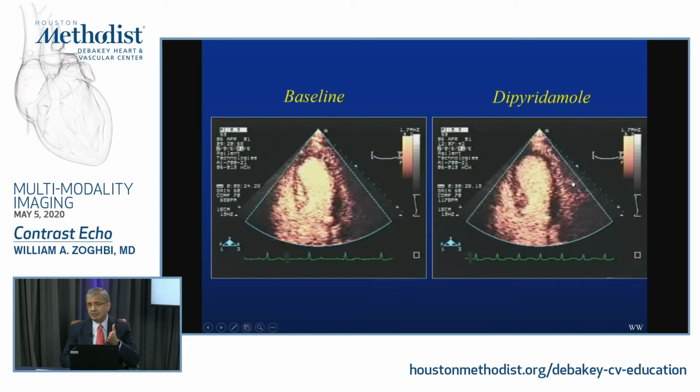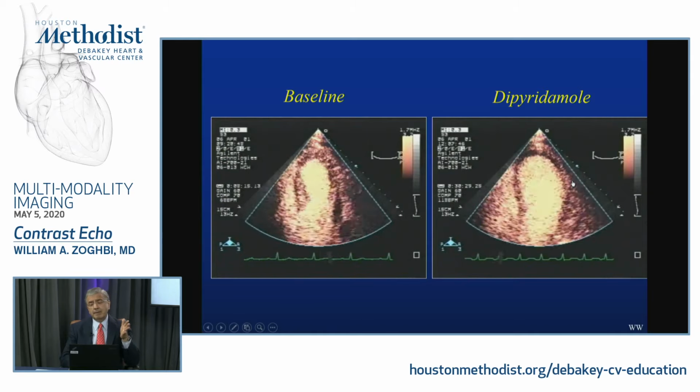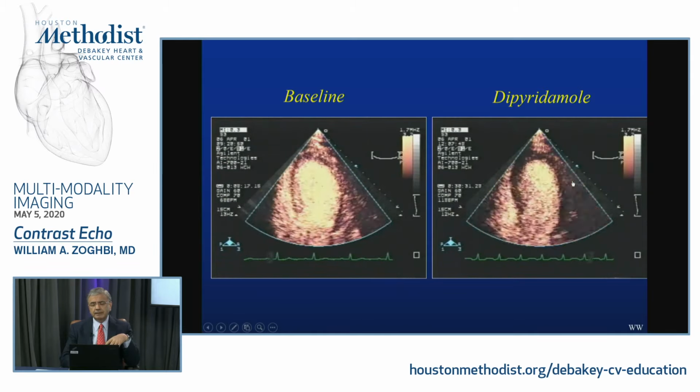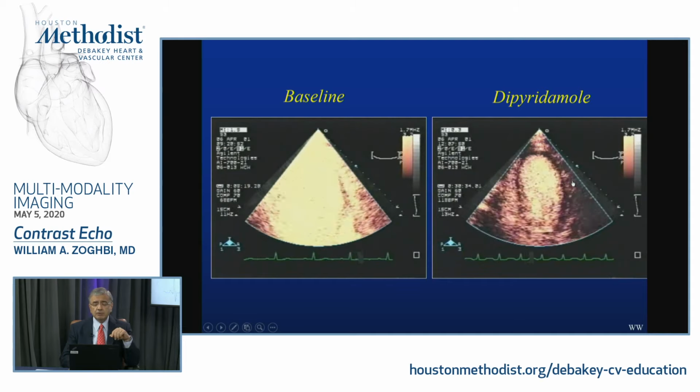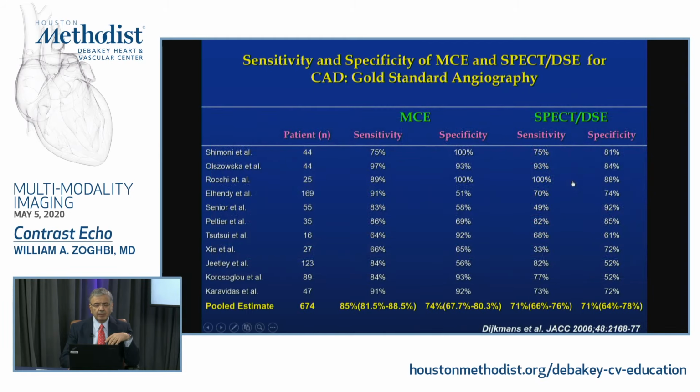There are a lot of competing methodologies for blood flow, including SPECT, PET, right, and many, and CMR also. So we have to also be realistic regarding blood flow and the competing technology for this to be a prime use of contrast echo with contrast.